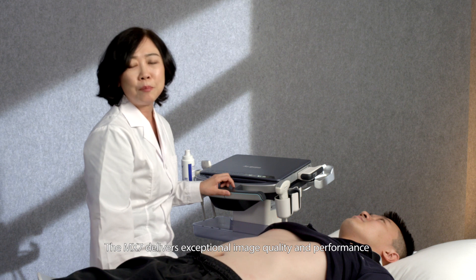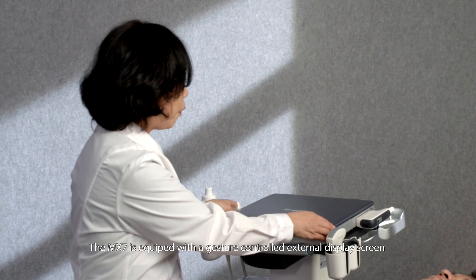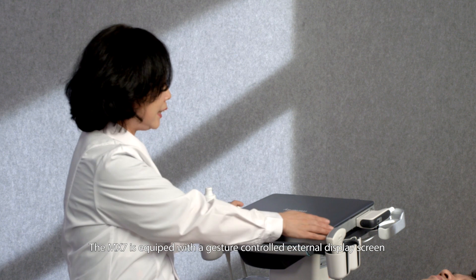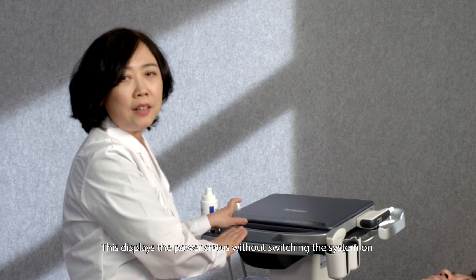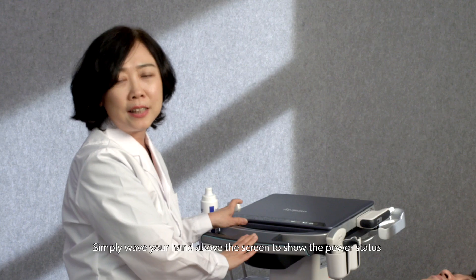The MX-7 delivers exceptional image quality and performance. It is equipped with a gesture-controlled external display screen, which displays the power status without switching the system on. Simply wave your hand above the screen to show the power status.